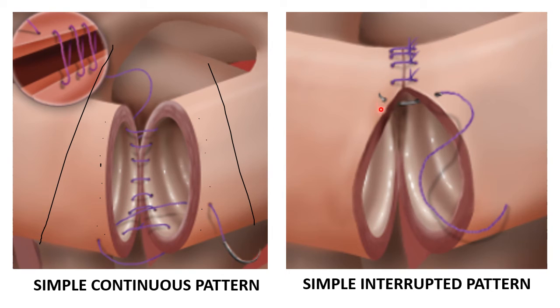Kapag sumobra ka ng lagay dito, it's very hard to fix. For example, you put these four, okay? You completed the whole diameter of the intestine, and then you see a leak here. You put another one, and then you see a leak here. Then you put another one.